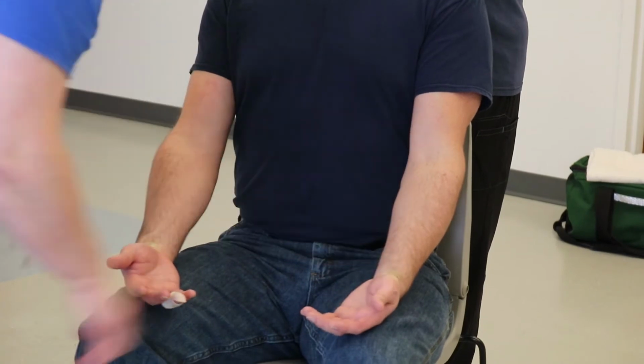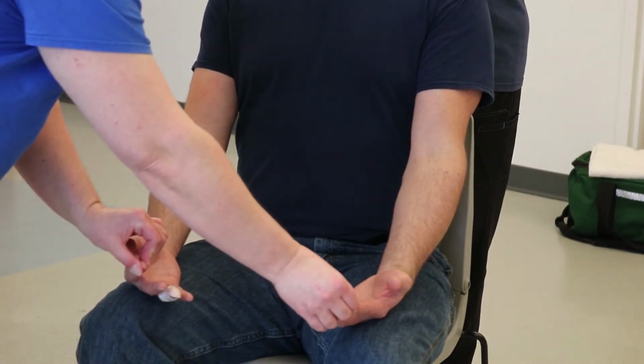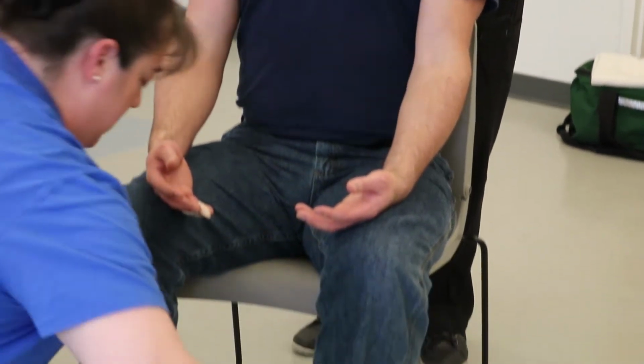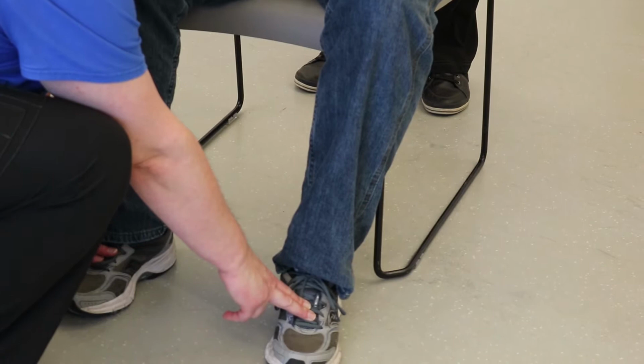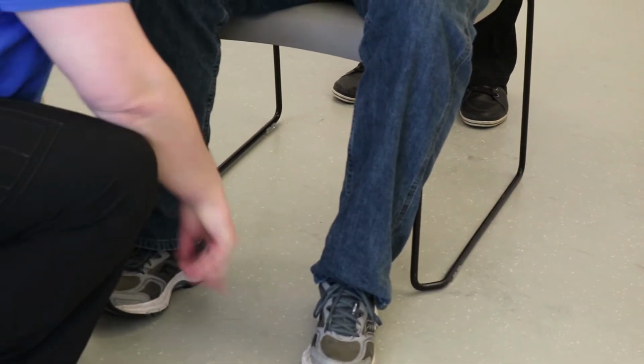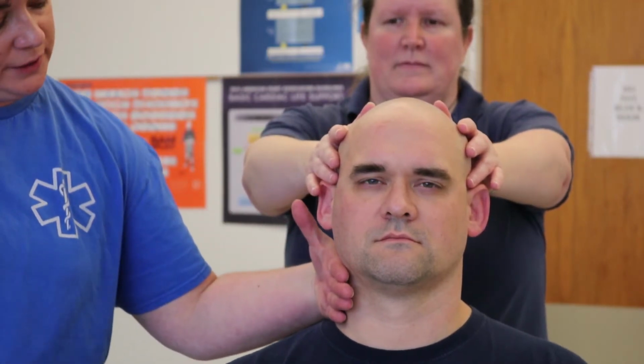I will check movement. Can you wiggle your fingers? And sensation. What finger am I touching? Index. I'm now checking the pedal pulses, bilateral, present and normal. Can you wiggle your toes? And what toe am I touching? Big toe. I'm now going to measure for the cervical collar.